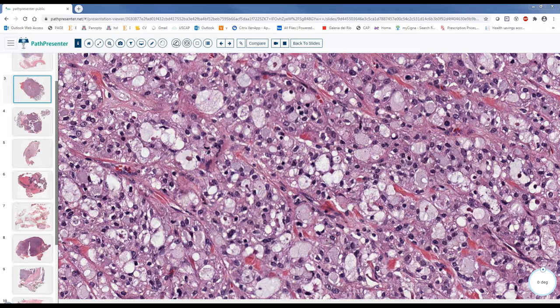All right, let's say we are in 2015, or actually 2014. What's your diagnosis now? It will be mammary analog secretory carcinoma. Excellent. Mammary analog secretory carcinoma. It's based on a very nice paper describing it. I think it is from UPMC, University of Pittsburgh. I'm not 100% sure, so don't quote me on this.